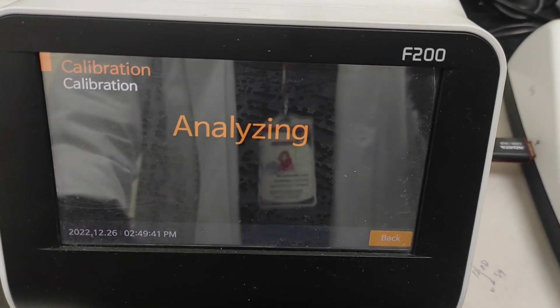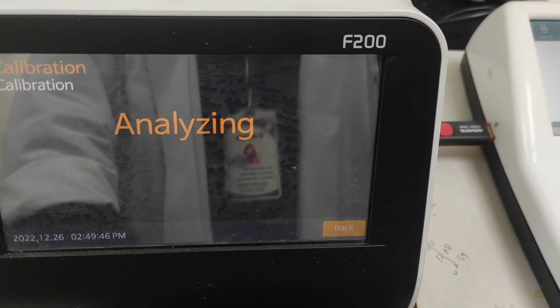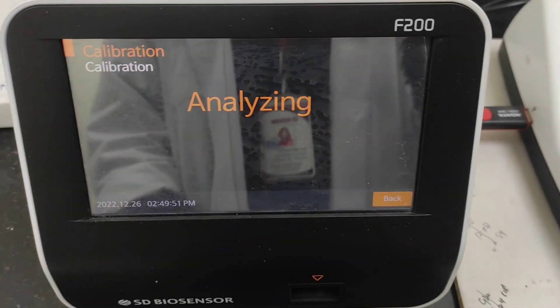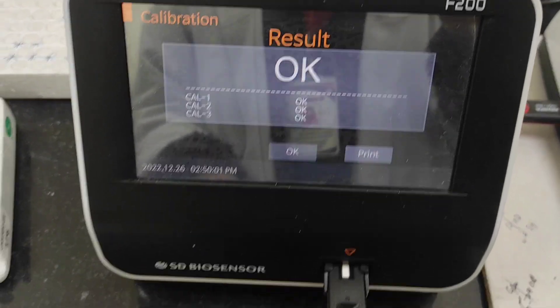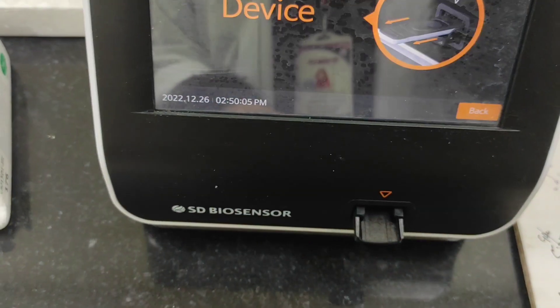You can see the analysis here in the display. Now you can see Cal 1, Cal 2, and Cal 3 — it says the calibration is done.